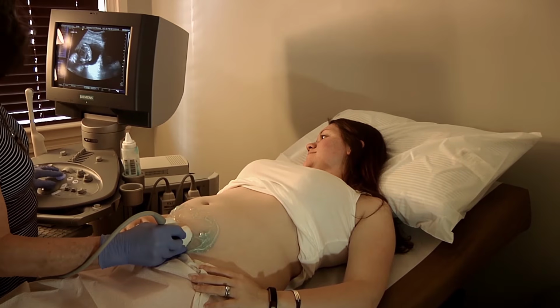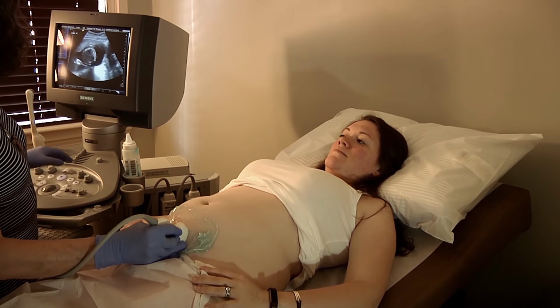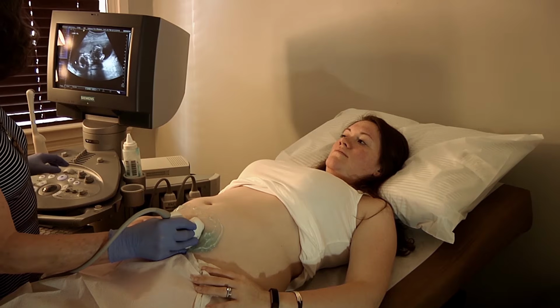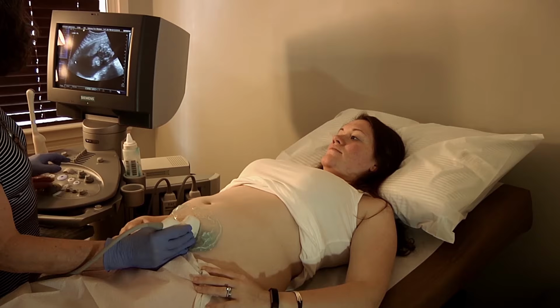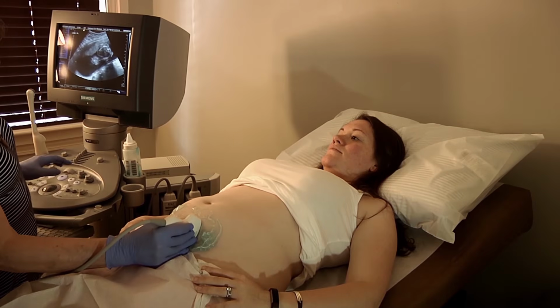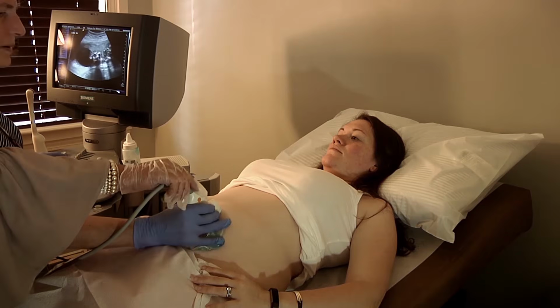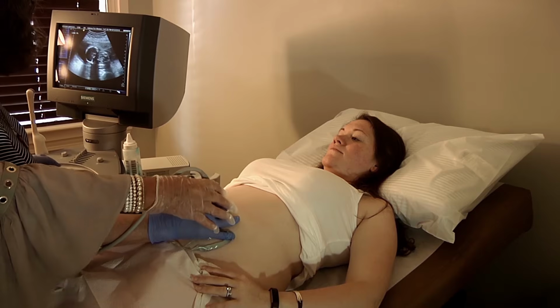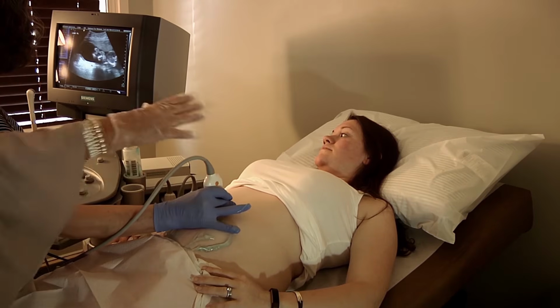Okay, so what will be our next picture? So now I want her upper. Her upper. Okay, so how would you move your transducer to get the upper? Good. Okay, so she's moving on up. All the way up. There you go. Stand perpendicular to her abdomen.